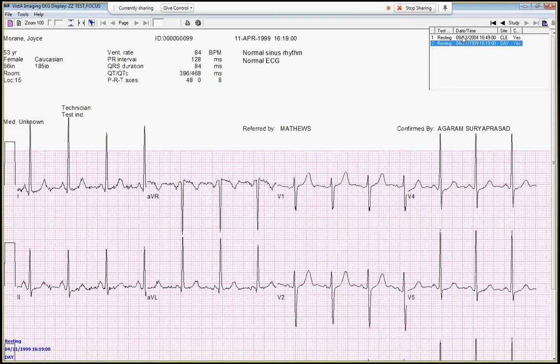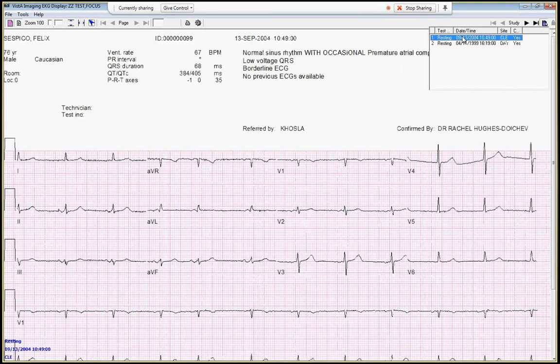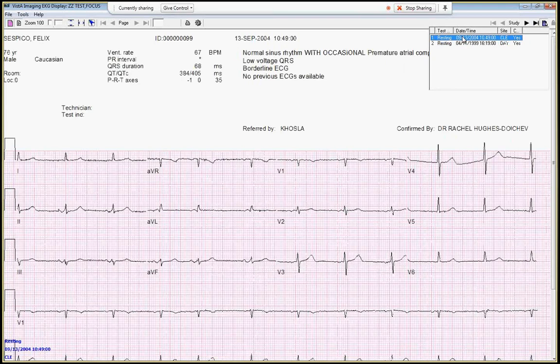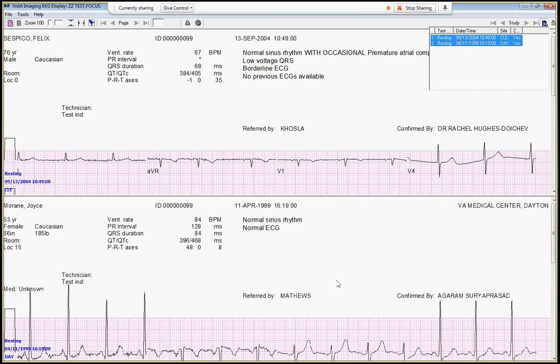Just assume that this is the admitting one and this is the baseline. So if we want to look at them side by side, you can hold the shift button, or the control button if they're not contiguous in this list. You can click them both, and they'll come up top to bottom.